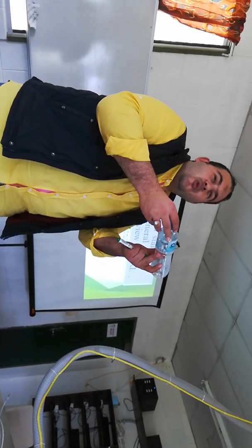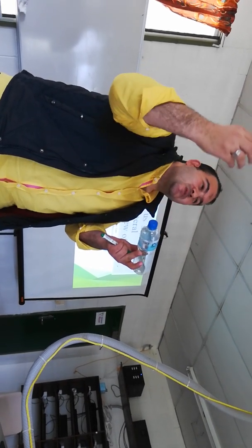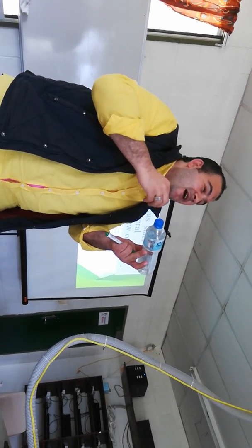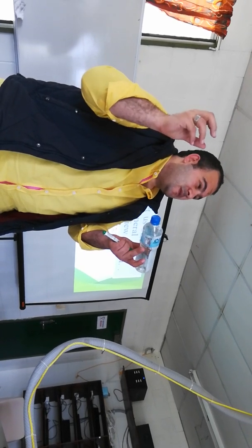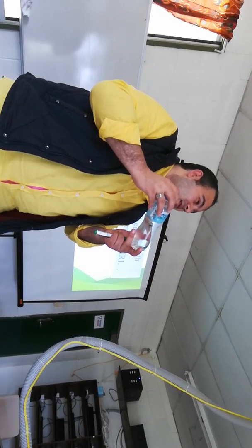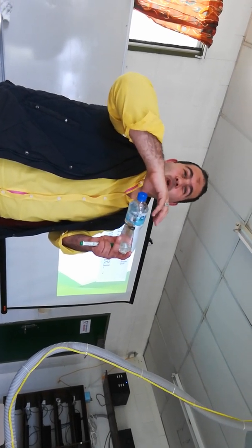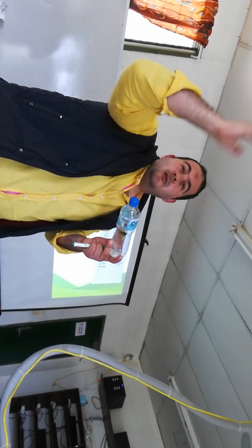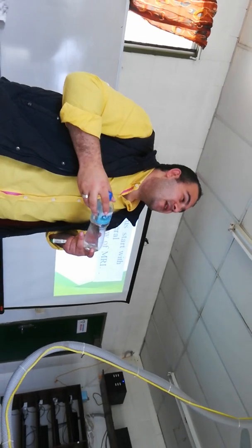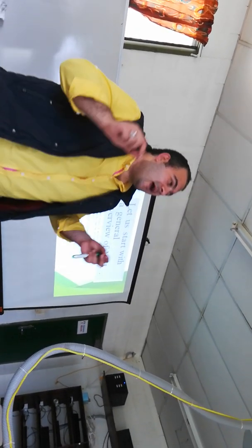And we send energy using a coil, and the patient absorbs this energy, and after we switch off the source of energy, the patient relaxes again and resends the signal which the patient absorbed, and we receive it and convert it to an image. Yes, this is an easy idea about MRI.